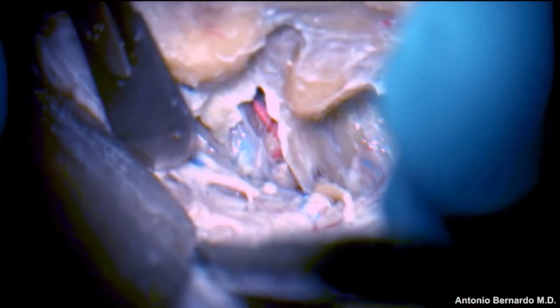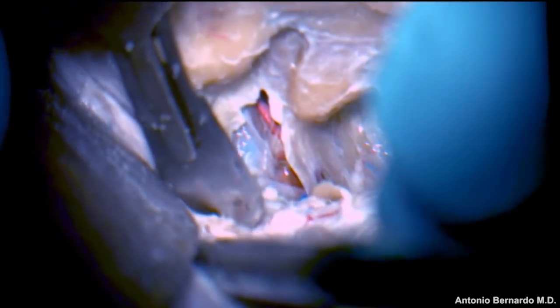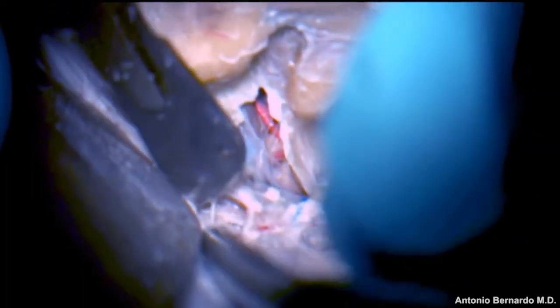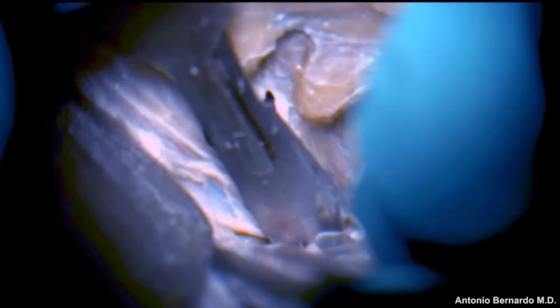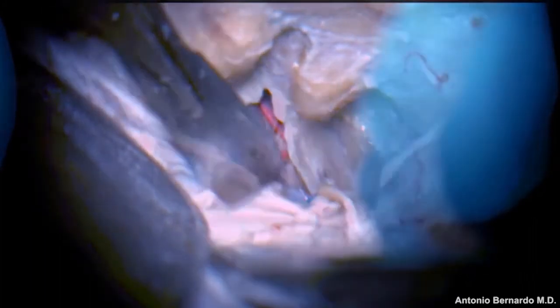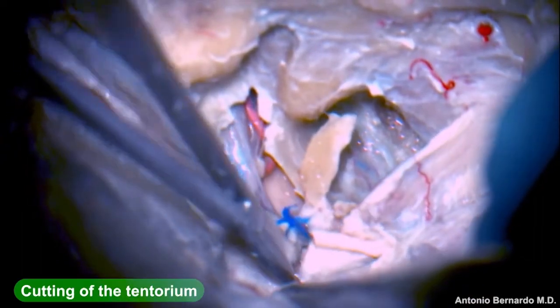And finally, the dura can be opened. The dura cut is a T shape. The first dura cut is parallel to the superior petrosal sinus, as in a standard subtemporal approach, towards V3. The second cut is perpendicular to the first. Care should be taken with the trigeminal nerve, which is crossing the petrous apex.